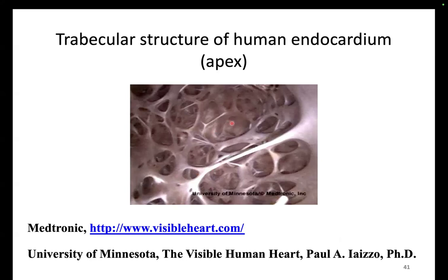But the reason I'm showing it to you is because the surface of the left ventricle, especially on the free wall or the lateral wall, the left side, is inundated with all of these little tiny chambers and links. And this is called trabeculation. And you rarely see trabeculation on, say, echo, or certainly don't see it on nuclear medicine.